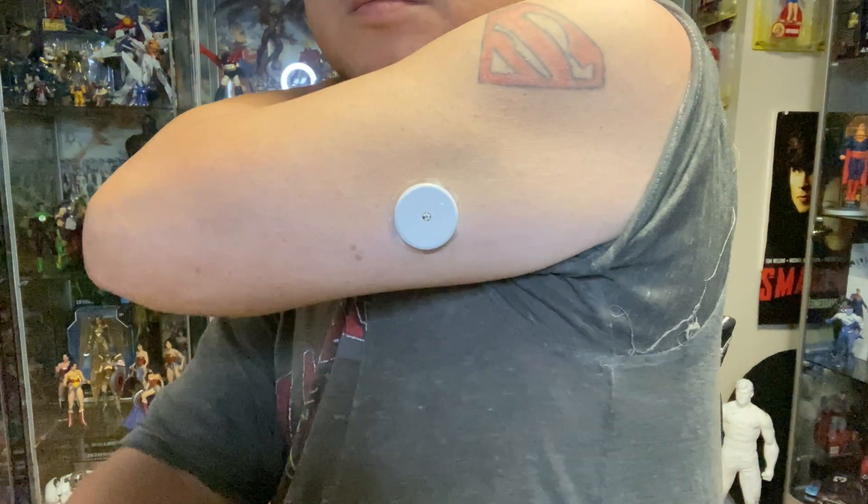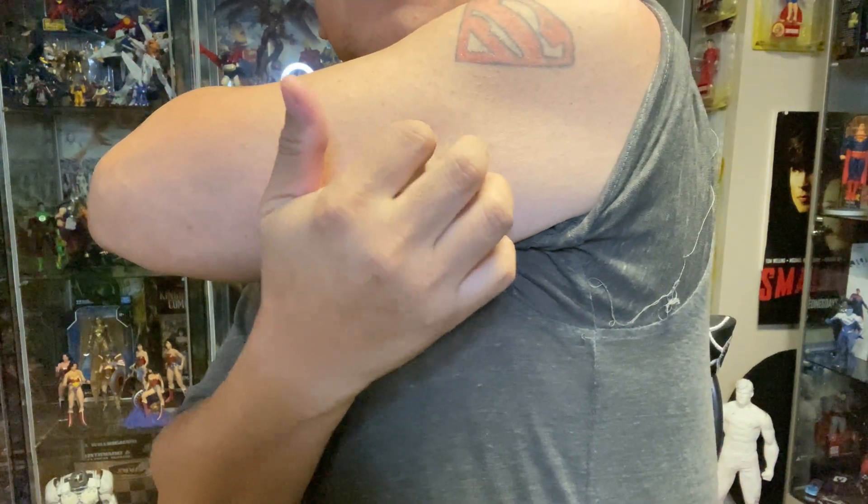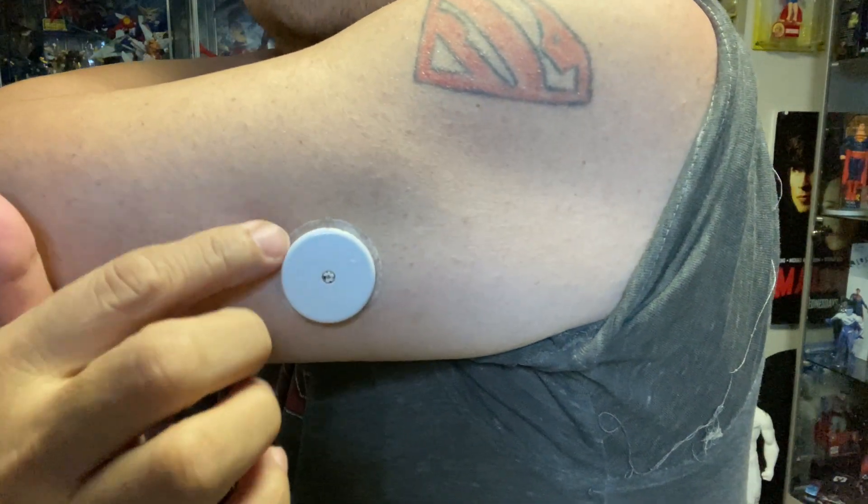To remove the sensor, work around the edges and slowly peel off the bandage.